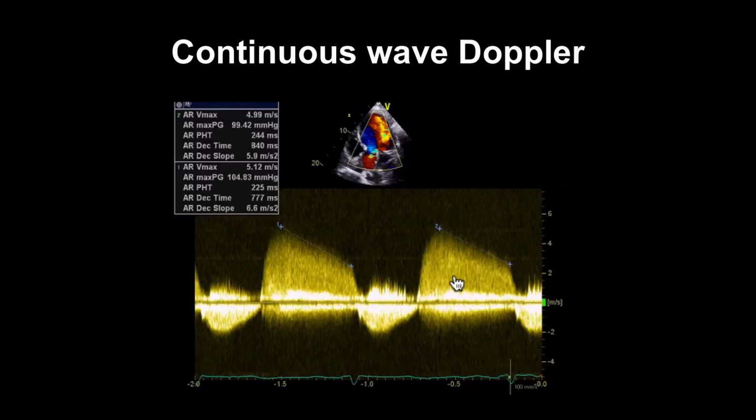And then I'm going to look at the flow in diastole, which is my regurgitant jet, and I'm going to compare the echo intensity. So how bright is this compared to this? If the AR was absolutely torrential, they would be very similar. This isn't as bright and echogenic and filled in. So I think this is probably going to be moderate aortic regurgitation.